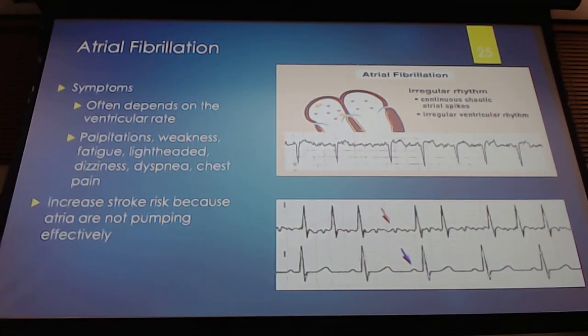On our ECG, we're going to see clearly some QRS complexes, okay, but in between there, we're going to see just a whole bunch of, I don't know, when you think about your 2-year-old writing you a letter, right? A whole bunch of this.